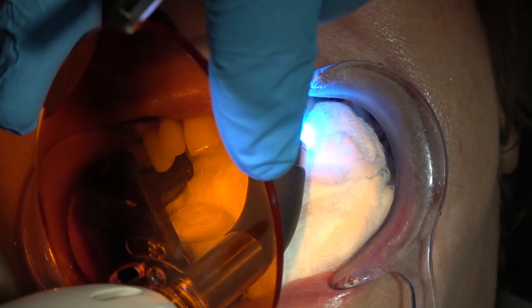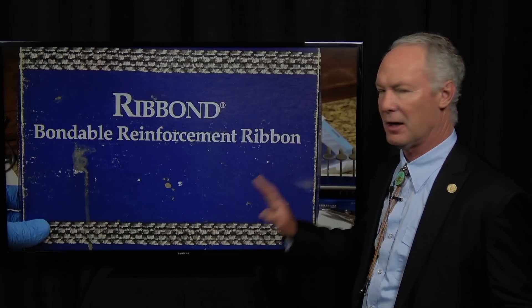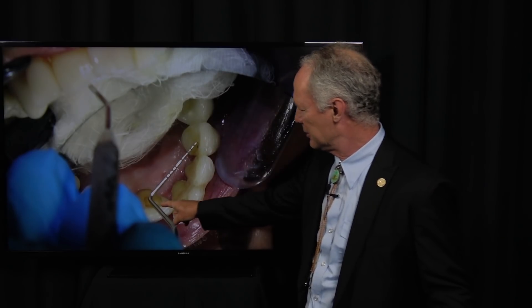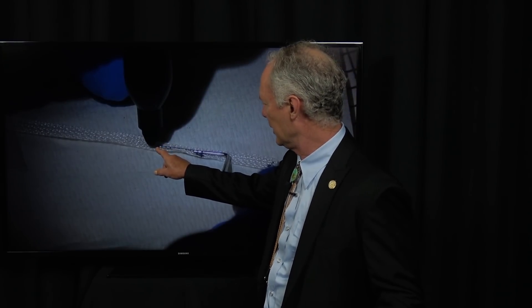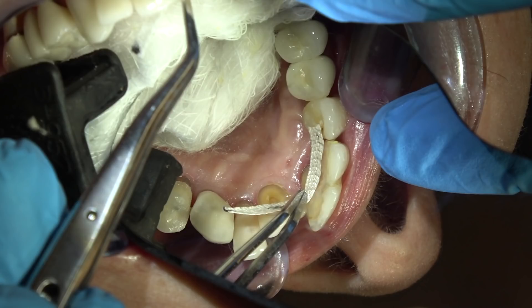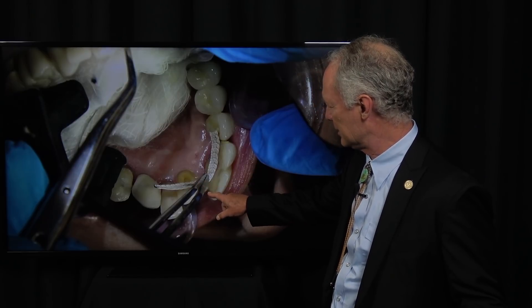So I'm curing the primer adhesive. Now this is the Ribbond — a bondable reinforced ribbon. This is a total patch-up technique. I'm using a periodontal probe to measure the approximate length from the cuspid to the central incisor. I'm measuring from here to here and making it a little bit longer because there's a curve. Then you have to cut it with these special scissors. I'm placing it on the teeth that have already received primer adhesive, and I've soaked the ribbon in primer adhesive.